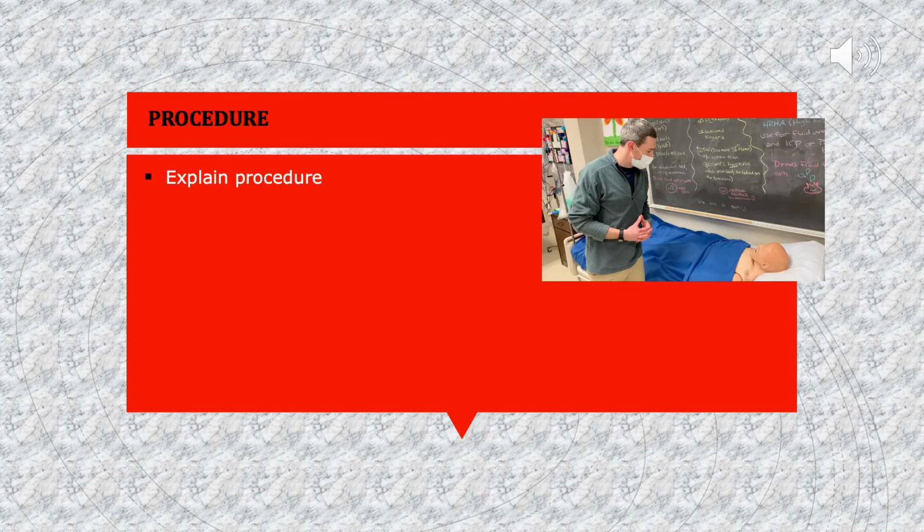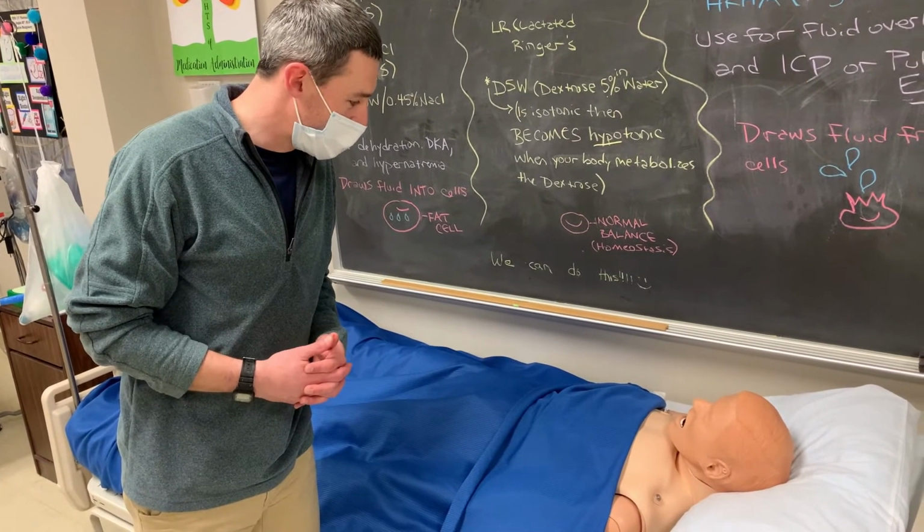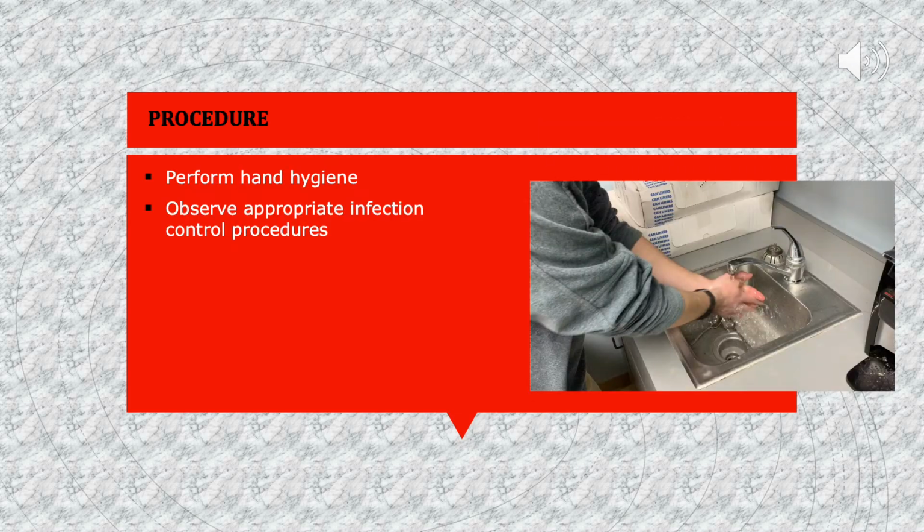Explain what you are going to do, why it is necessary, and how the patient can participate. Explain that venipuncture can cause discomfort for a few seconds, but there should be no ongoing pain after insertion. If possible, explain how long the IV will need to remain in place and how it will be used. Discuss how the results will be used in planning further care treatments. Sir, your physician has ordered an IV. Perform hand hygiene.